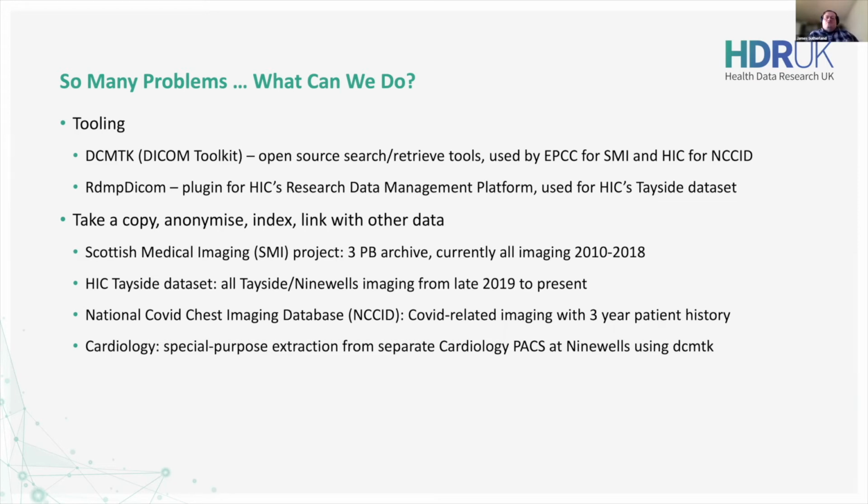And then we do more filtering and anonymization on that later. There's the RDMP DICOM project, which you can find on GitHub. That's an extension to a plugin for HIC's research data management platform, which is HIC's data management tool. And we've been using that tool now for just over a year, pulling a nightly feed of all of the data within the Tayside or Dundee regional PACS.